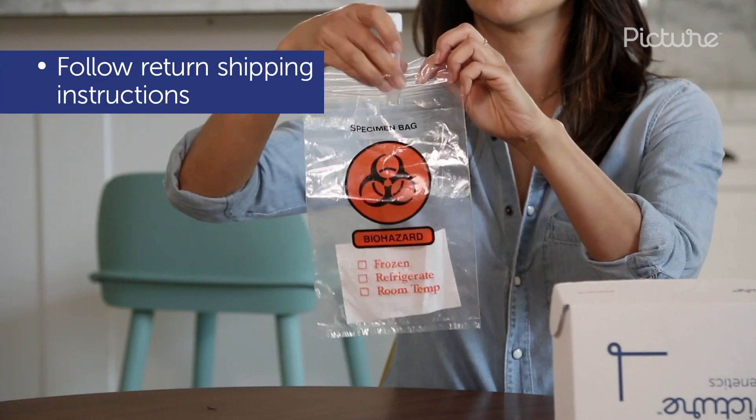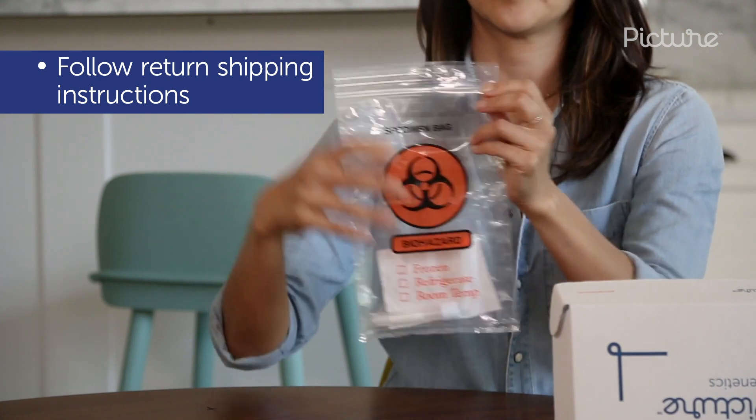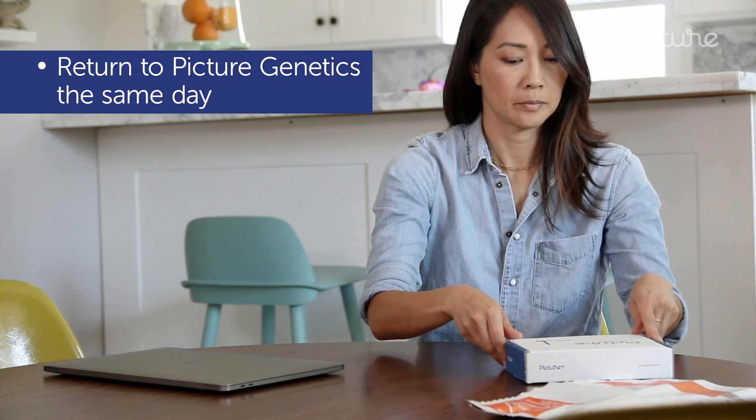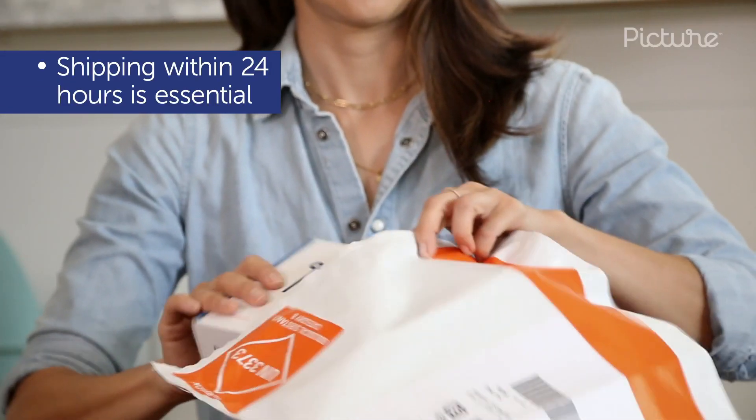Follow the return shipping instructions in your kit, being mindful not to ship after the last pickup of the day or on the weekend, and return the test the same day you took it. Shipping the test back within 24 hours is essential.